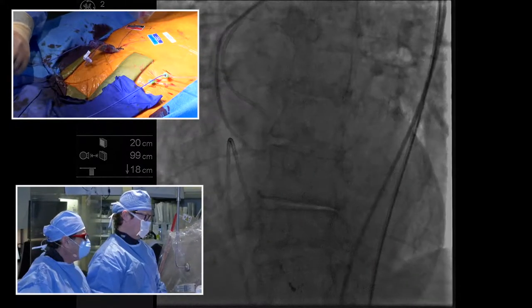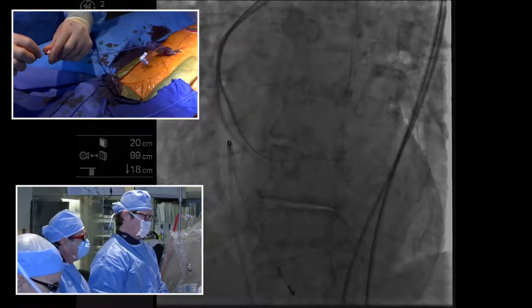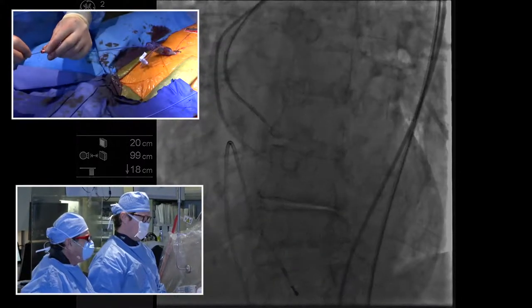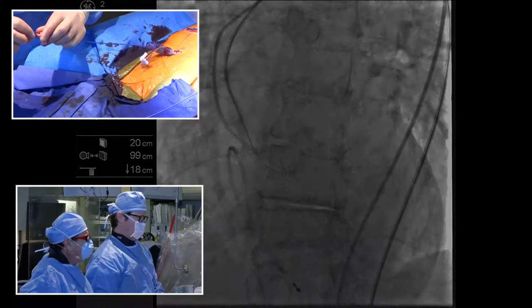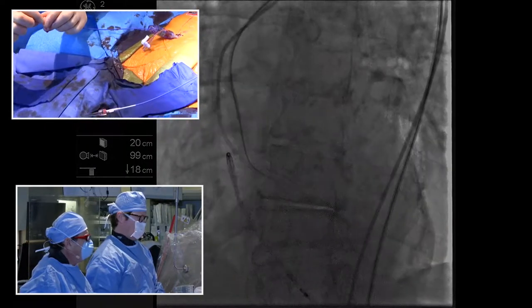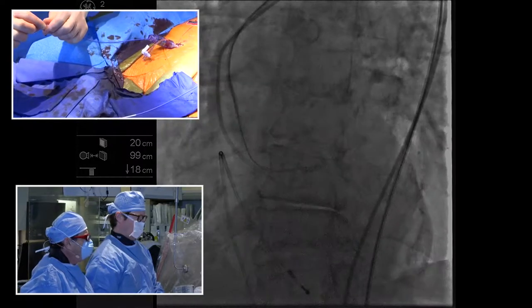You can see the calcium around the pigtail catheter, right? That's the valve, and he's got to get this wire through. You see he's probably a little bit too high there, now he's probably too low, and now he's in the middle, and we're supposed to go right through there, but it doesn't. This valve area is 0.7.